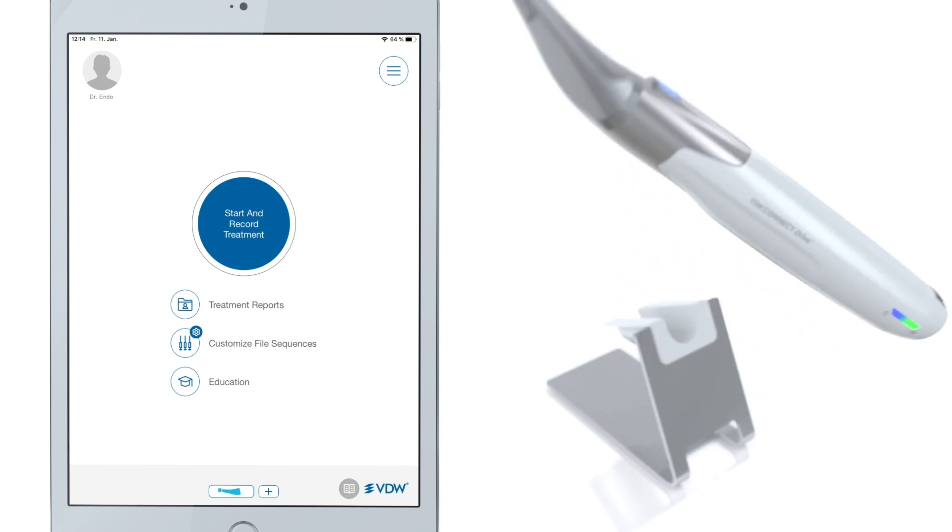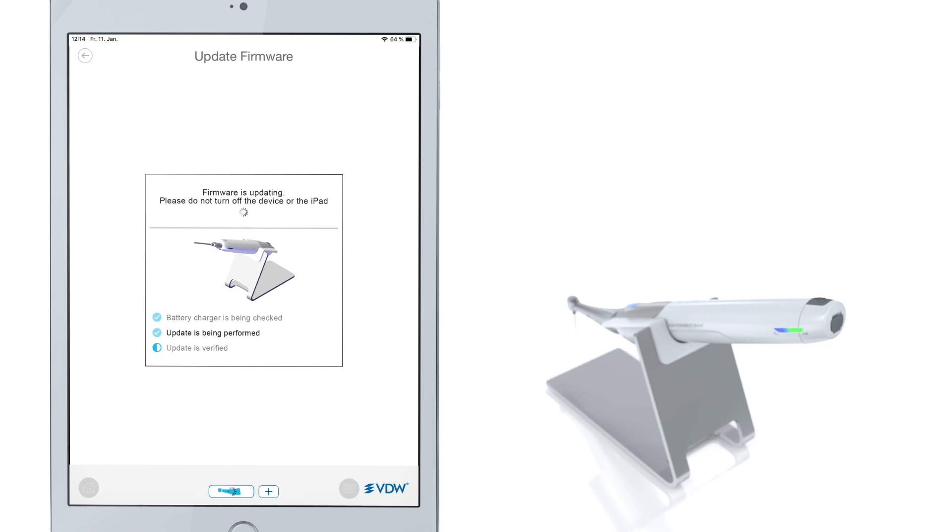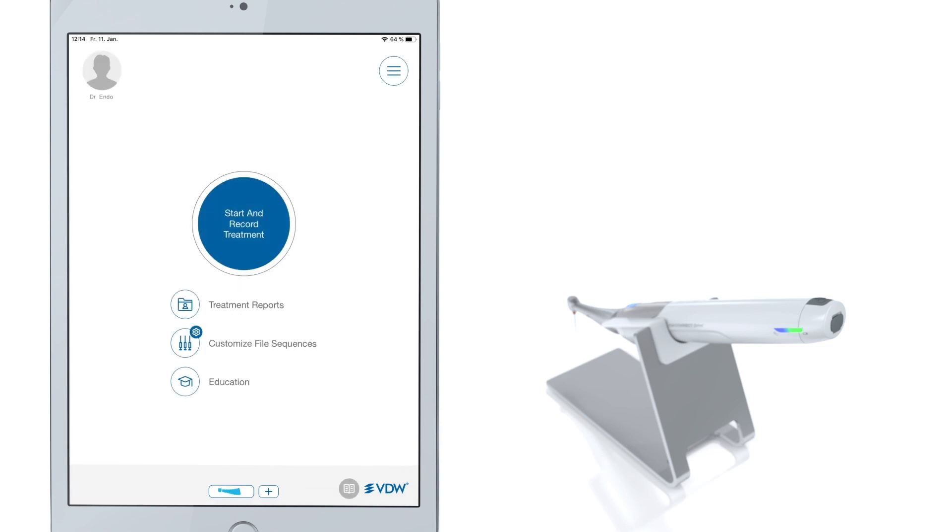If you're connecting the VDW Connect Drive for the first time, you will be asked to perform a firmware upgrade according to the instructions shown on your iPad screen. Once the upgrade has been completed, you're ready to go. You will not need to repeat this step again.